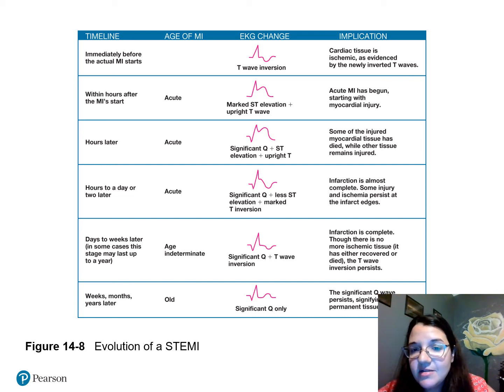But notice what happened to my T wave. It has become inverted, meaning I am at least a day after the start of a heart attack. Infarction is almost complete. Some injury and ischemia persist for the infarcted edges. Now remember, we have STEMI and non-STEMI, right?